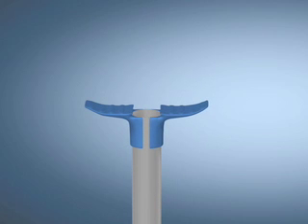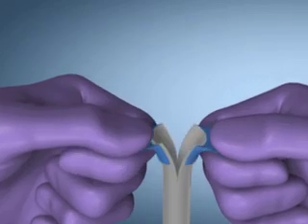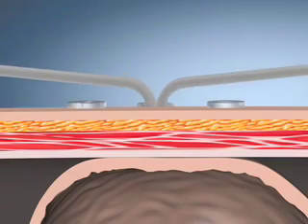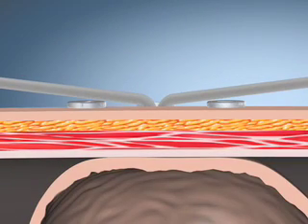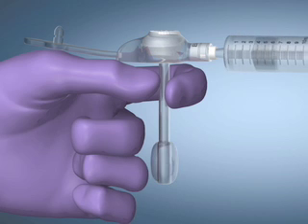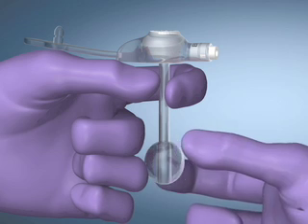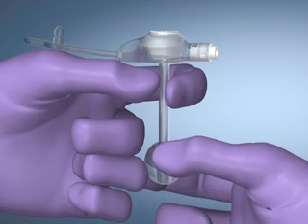Select the appropriate Kimberly-Clark Mickey low-profile gastrostomy tube while maintaining stomach and stoma tract access via the pre-positioned peel-away sheath. Peel the sheath down to the skin level. Using the 6 milliliter Luer slip syringe contained in the kit, inflate the balloon with 5 milliliters sterile or distilled water through the balloon port. Remove the syringe and verify balloon integrity by gently squeezing the balloon to check for leaks.